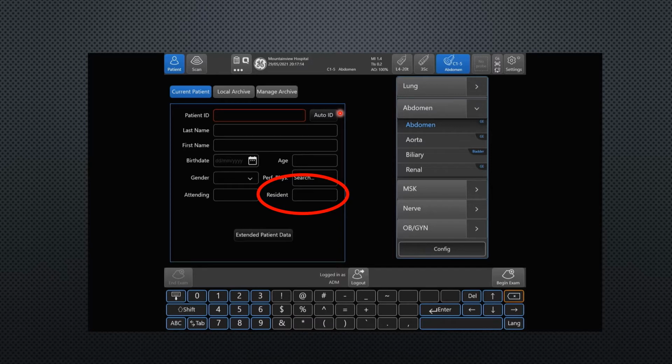double check it. Don't put any of this other information in because it will interfere with QPath's ability to tell what you wanted to do or which patient it is, and it can actually screw it up. So please don't put any other information, just scan the wristband and put your 3-4 in. In the future, we may ask you to put some information for the attending. How we'll do that remains to be seen, but that's a future possibility.